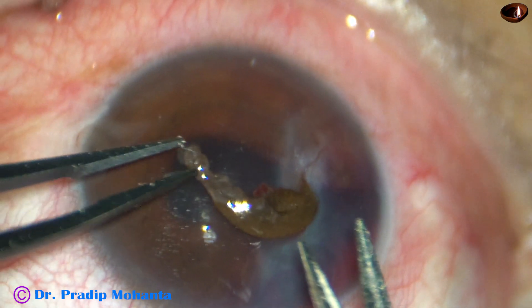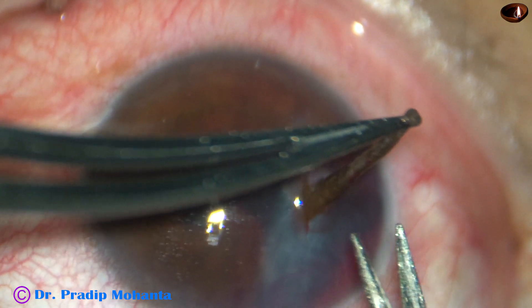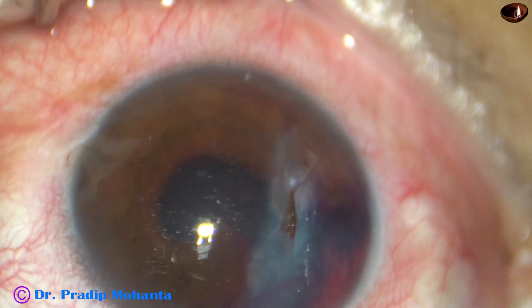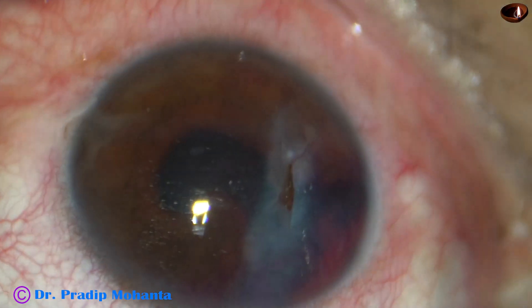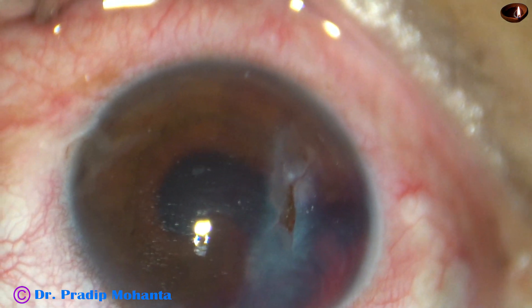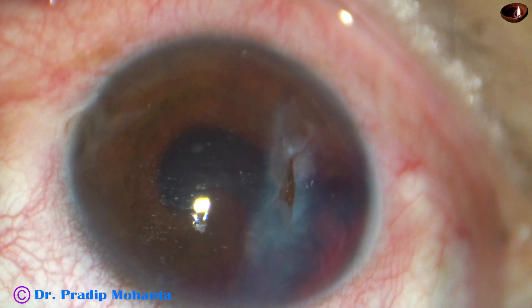So I have taken this Vana scissor and these forceps, and I am excising the prolapsed iris. A little bit of iris is incarcerated in the wound.